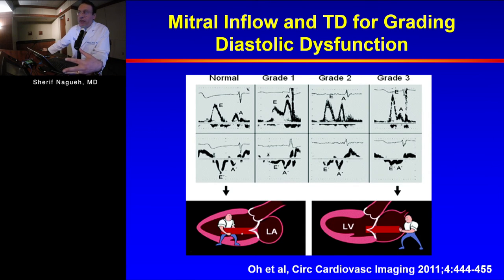If you have an older individual where the annular velocities are lower and commensurate with what fits that individual's age, they are not necessarily having diastolic dysfunction. Our lab uses the term impaired appropriate for age. With age, there is some decline in diastolic function, mostly in individuals who are not physically active. It has been shown that individuals who are physically active, even if older, can still have normal velocities. So that's the first step.